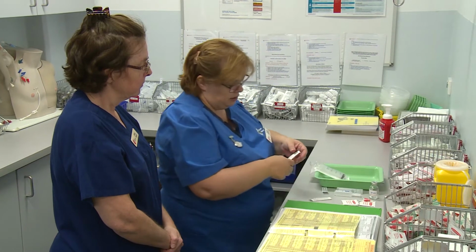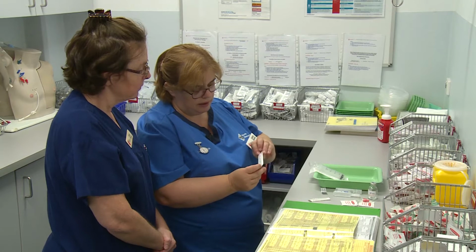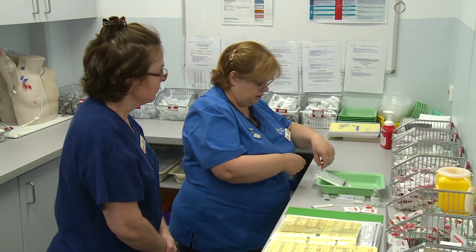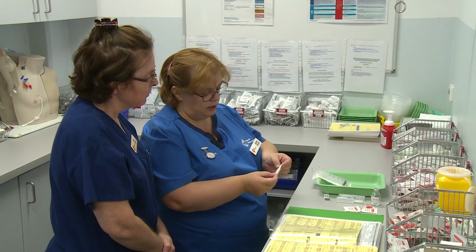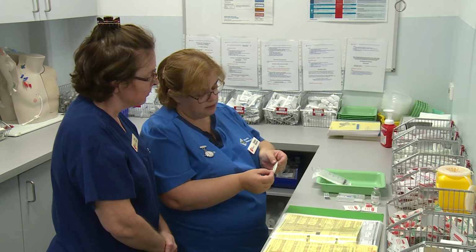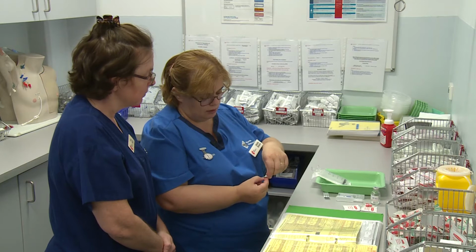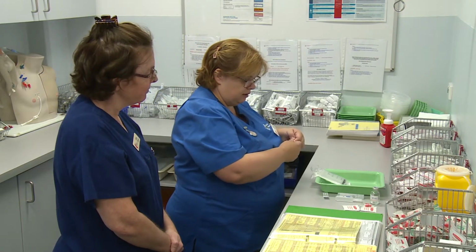I have a drawing up needle and that expires 2023, and the integrity of this packaging is intact too. And my vial access cannula, or BD blunt plastic cannula, is intact, and that expires in 2023. Okay, so that's ready to go.